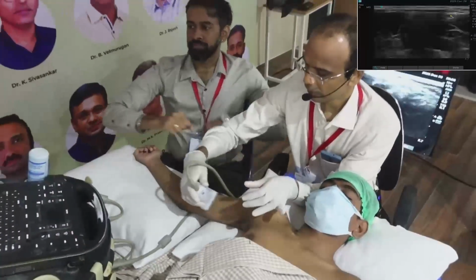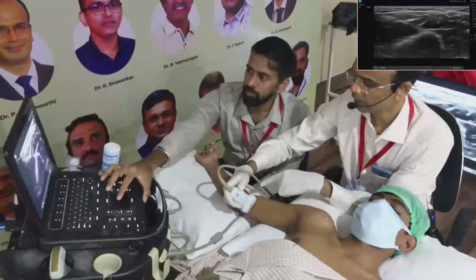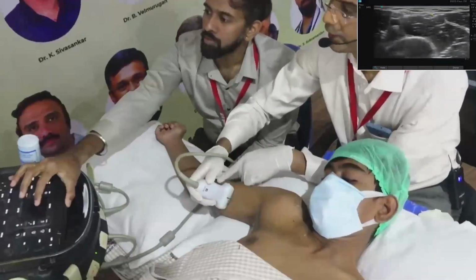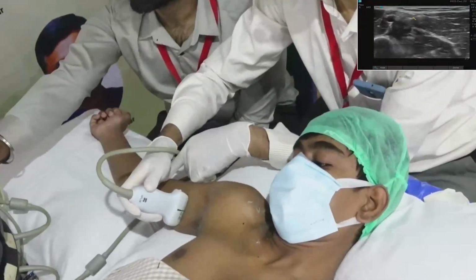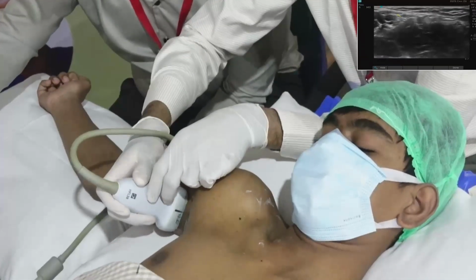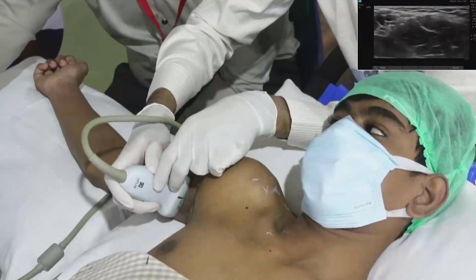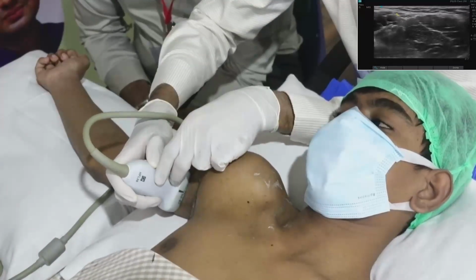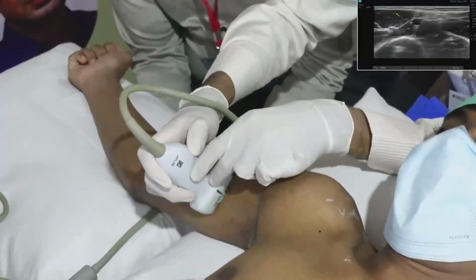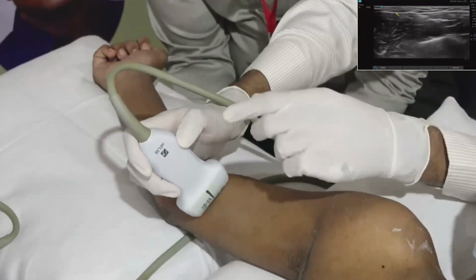So again, to revise, I'll come back from the medial epicondyle area. If you trace the ulnar nerve in the subcutaneous area and come near the axillary artery, giving the drug around the ulnar nerve usually takes care of the medial cutaneous nerve of the forearm also. The other way of doing it is to look for the basilic vein and give the drug there, if possible.